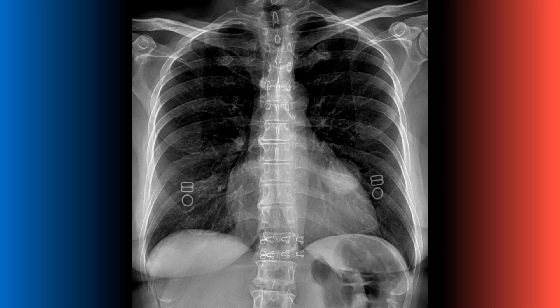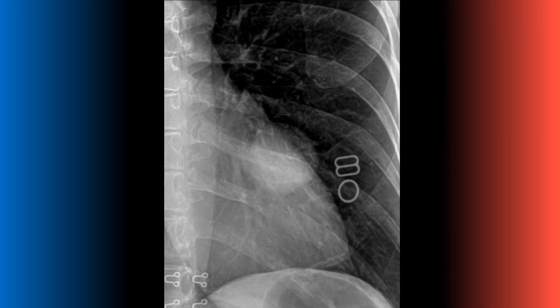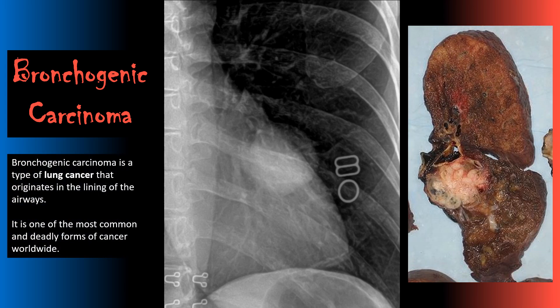Let's take a look at this frontal view of the chest. You should see an abnormality within the left lung field, and this is a good example of an aggressive appearing radiographic lesion. There's no obvious evidence of calcification and it appears very large — this ends up being a bronchogenic carcinoma. Bronchogenic carcinomas are one of the most common forms of lung cancer.